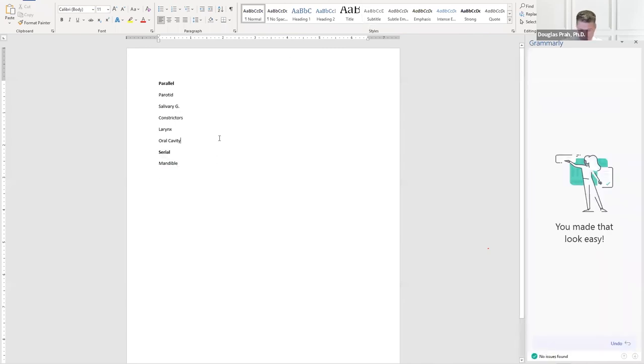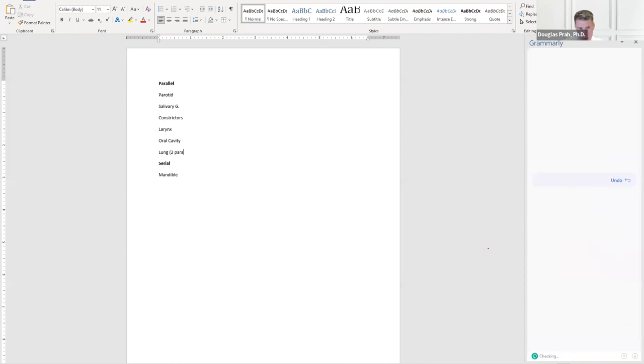So let's think lung. I will use like two parallel constraints, one at like 20 gray and then usually one at 5 gray. Heart, I'll usually use two parallel again. There'll be one for the mean dose, and then one for like a V20 or V15 depending on what dose levels I'm usually controlling.